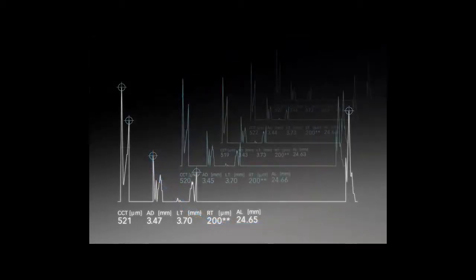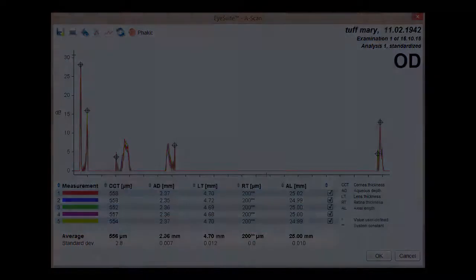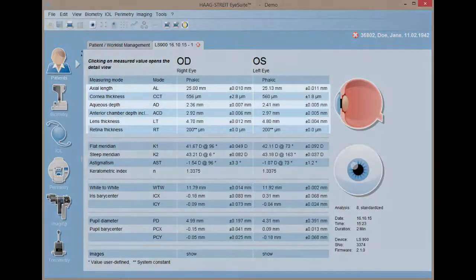These important data points are needed for advanced IOL power calculation formulas such as Haigis, Holladay IOL Consultant, Olsen, and Barrett formulas, and it's especially important for the IOL calculation for hyperopic eyes. The single acquisition process saves valuable time by streamlining your examination process. All length measurements are displayed in the Eyesuite results overview page.